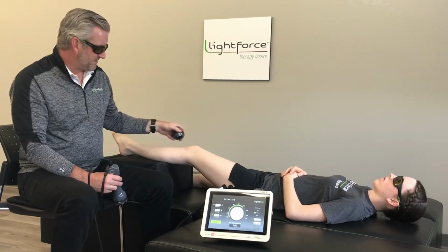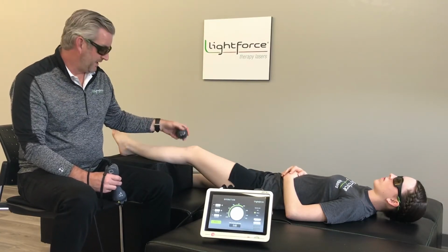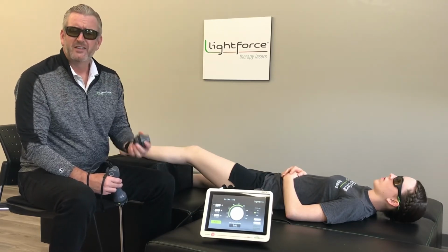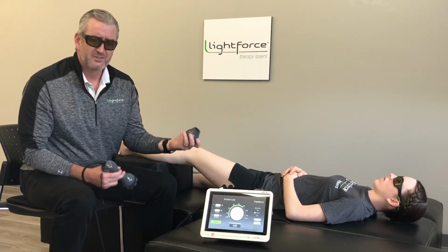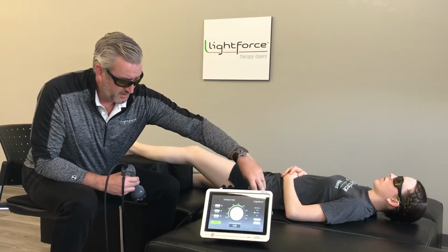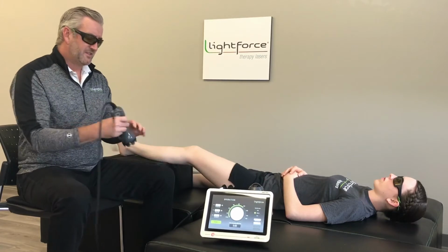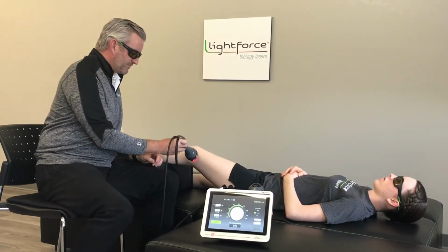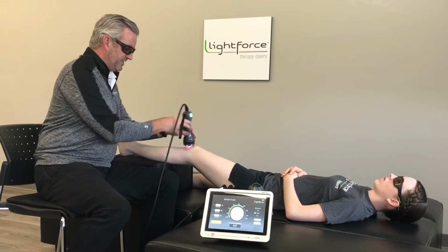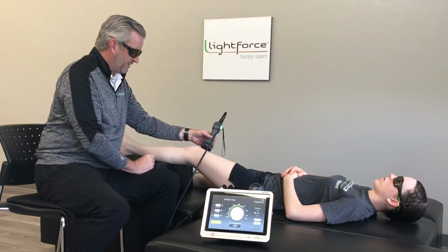But sometimes patients that are, especially if they're in more acute levels of pain, they don't like that to be rolled over the bony prominences of the knee, and they might not tolerate that quite as well. But it's certainly up to your choice on which one would be a better head to choose from. In this case, we're going to use the large cone. And what you're going to try to do when you're treating that is just distribute that energy equally around that capsule.